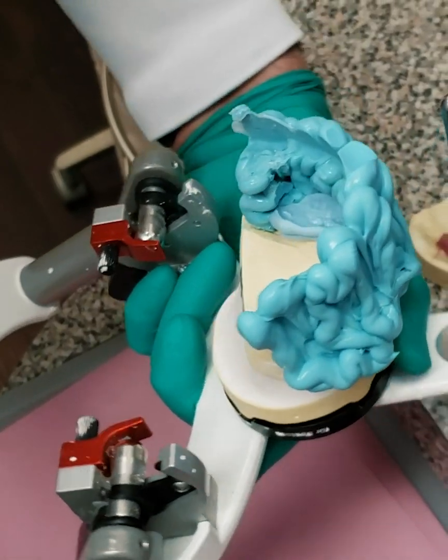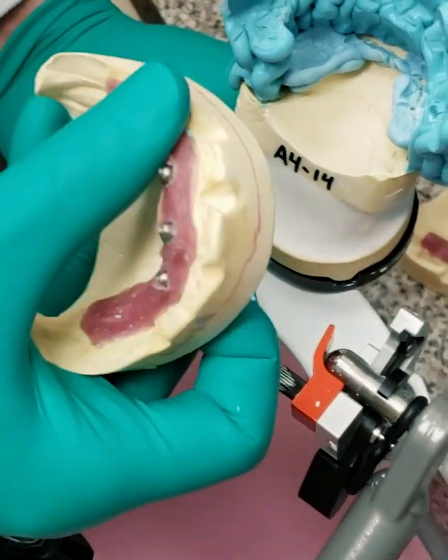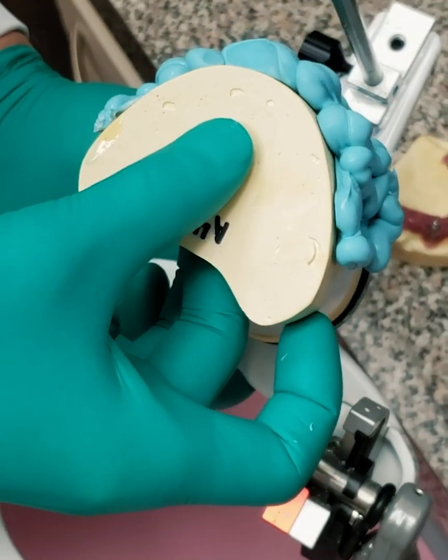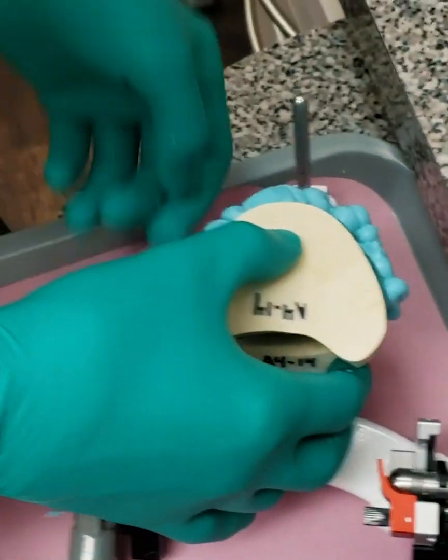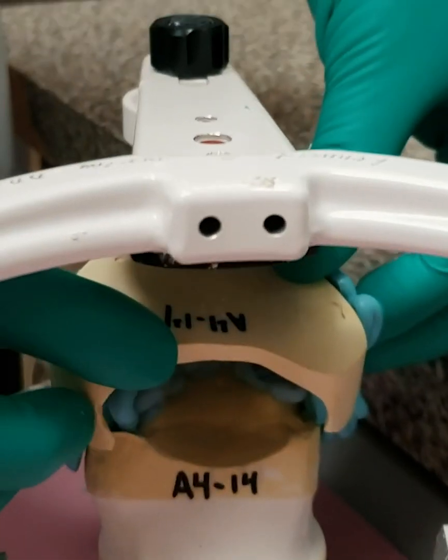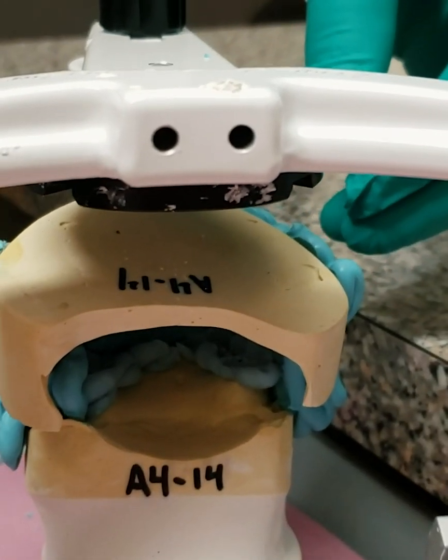The laboratory mounts: you have the upper study model that's already been mounted, and they then take the lower working model, place the lower working model on here. Then what they wind up doing is just mounting this to the vertical, and as you can see, it's very stable, and then they just add plaster.